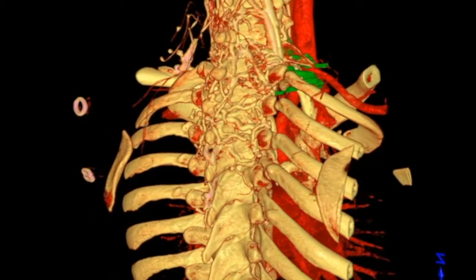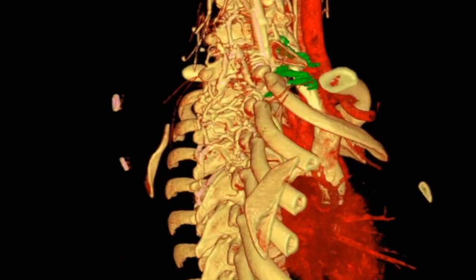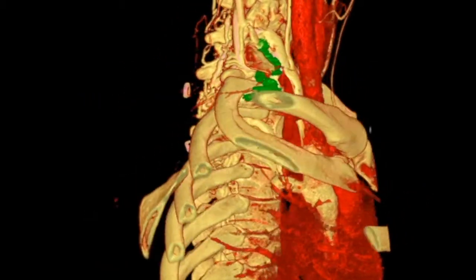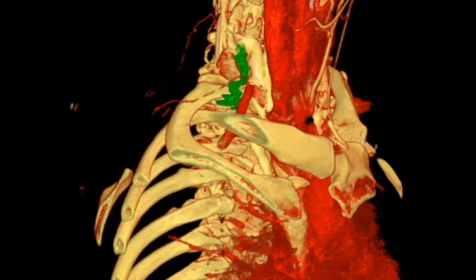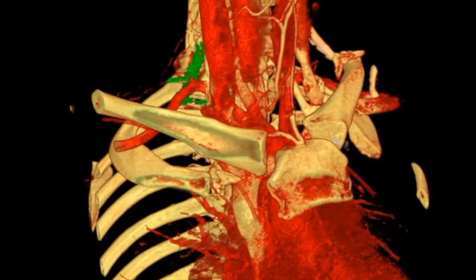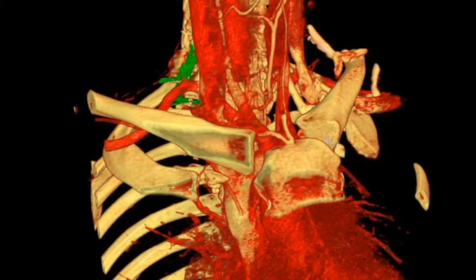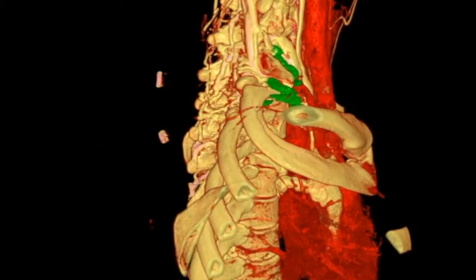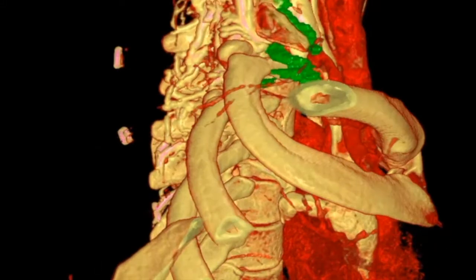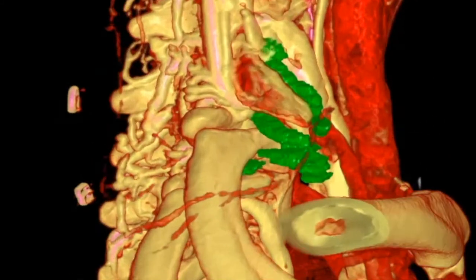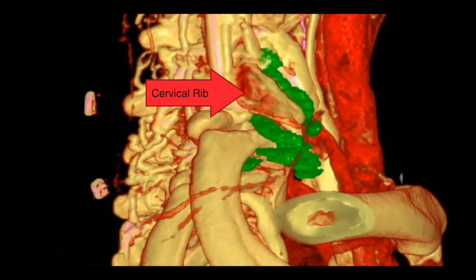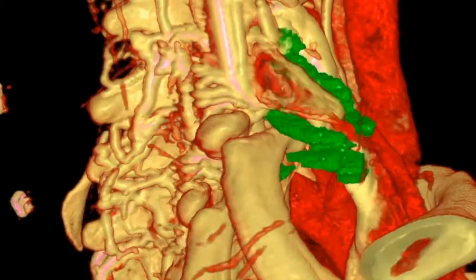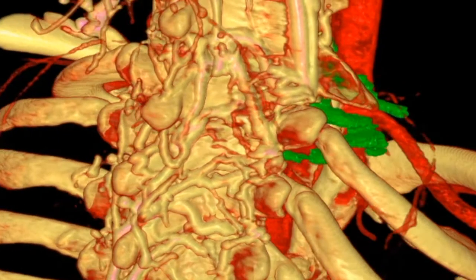Here we have a 3D reconstruction of this patient's CT angiogram. As you notice, the yellow structures are the bones and the blood vessels. The red structures are the major arteries.